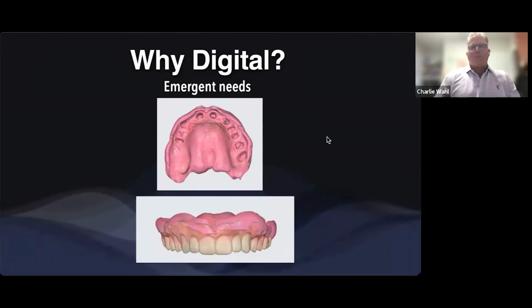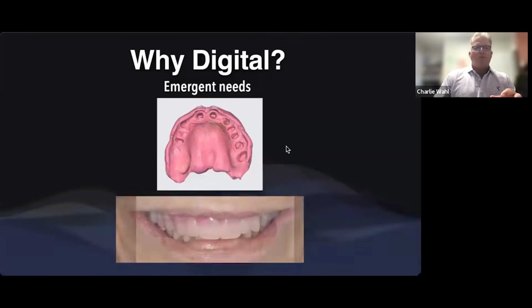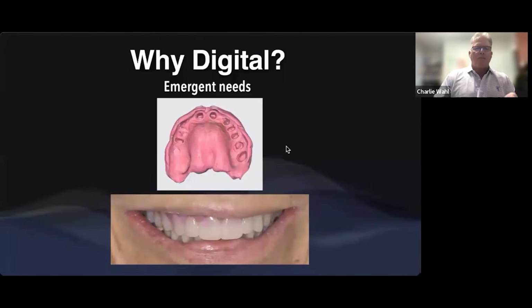Which brings me to this: whenever we scan a patient, just get more data than you need. Always get the palate, try to get as much tissue as you can, because you never know what we may need the scans for. In this case, we were short on the vestibule. We didn't have a palate, but I was able in the software to give this patient something. Our plan was to take this try-in, seat it over the preps, and take a border molded wash impression. Now we had a palate and a very well-defined border, and we would make an overdenture over these preps.